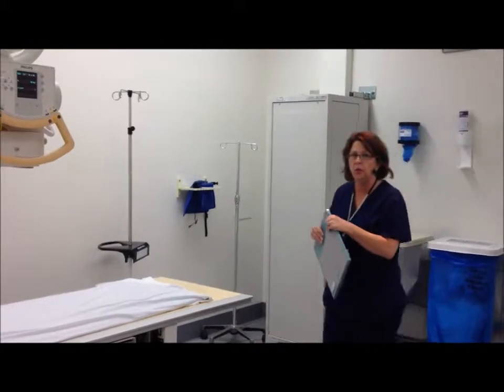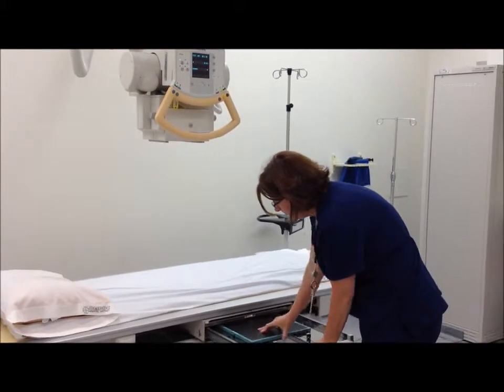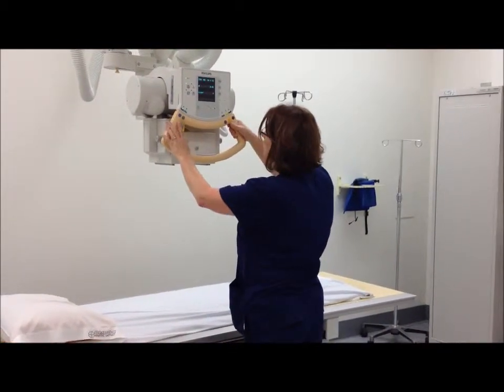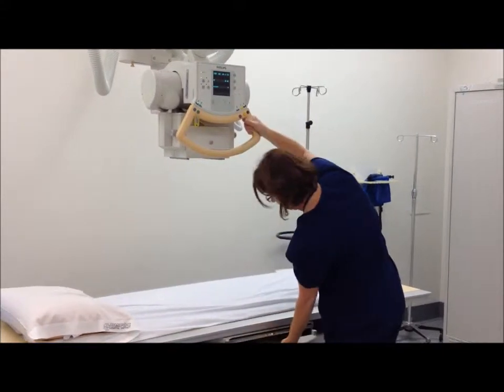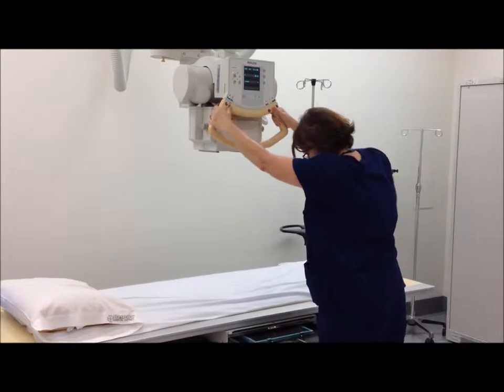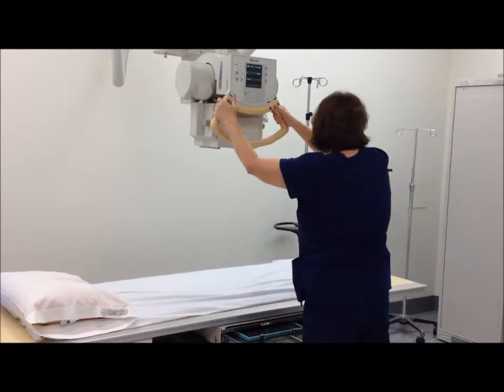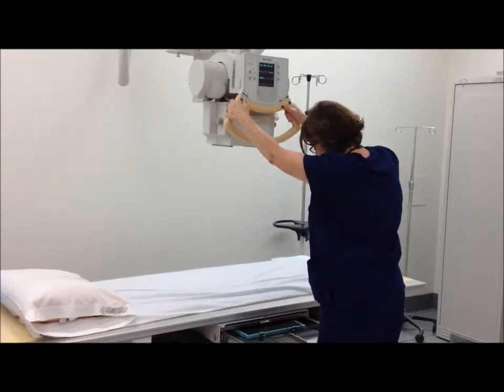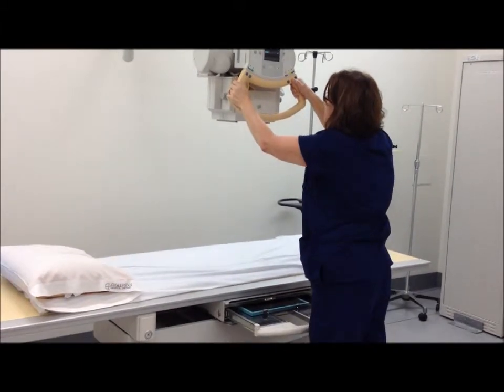Okay, to set up my room, I bring my cassette in and set my cassette in the table bucky. I line up my tube in my bucky. Once my table and my bucky are lined up, I set my distance to 40.